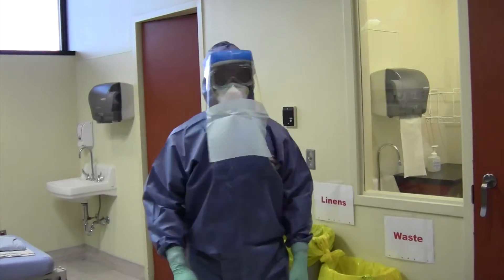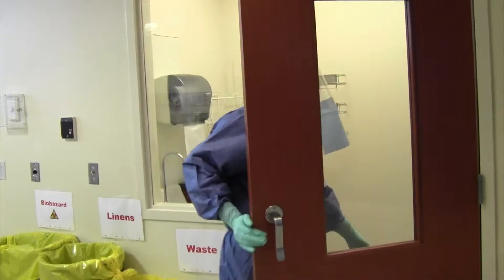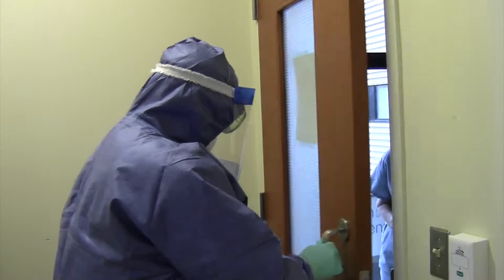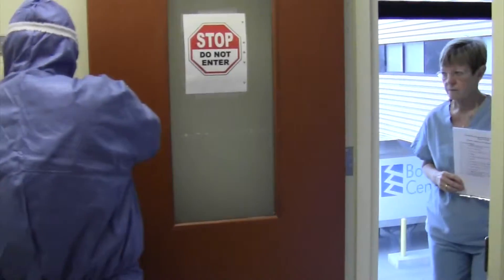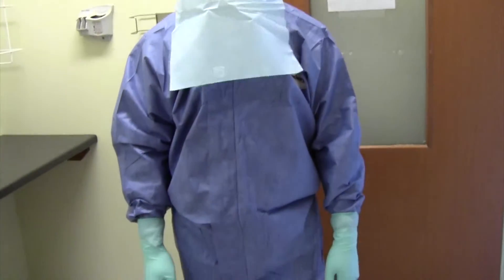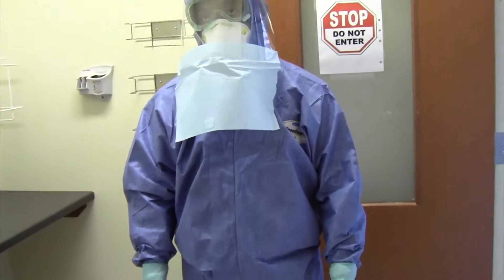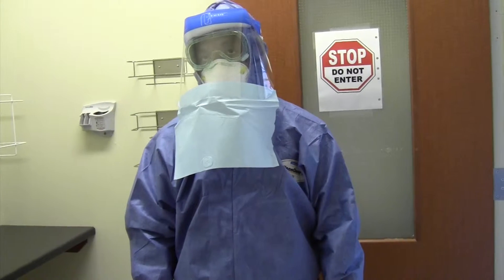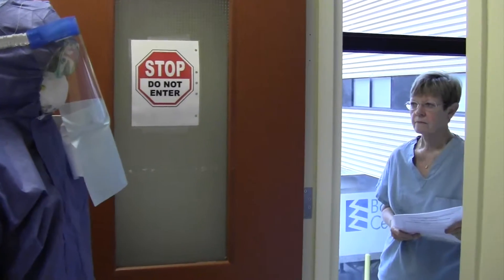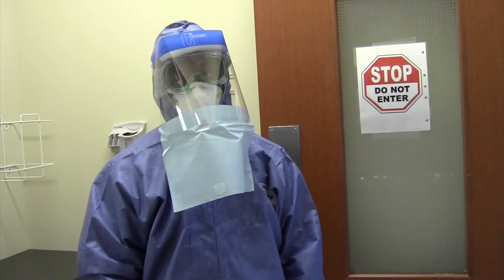Brian has now completed his care for the patient and is ready to exit the patient's room. He enters the anteroom and shuts the door behind him, then opens the door into the hallway. Remember, all doffing or removal of PPE will occur in the anteroom. The clinician observer will now be positioned in the hallway to guide Brian through the doffing checklist. Now that they are in position, we can begin the doffing procedure.